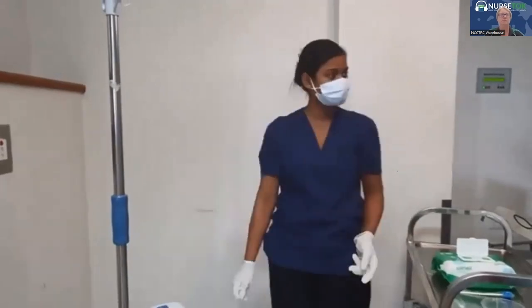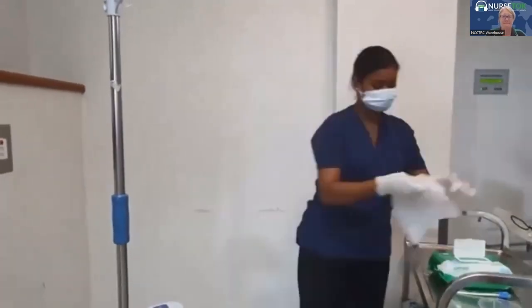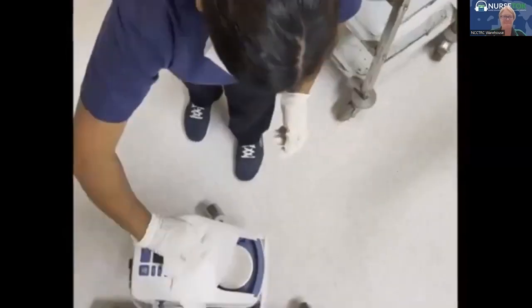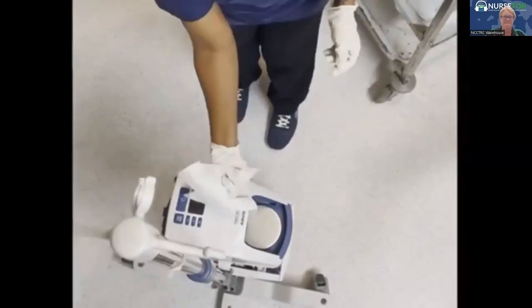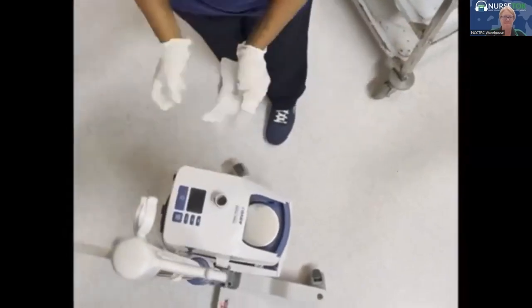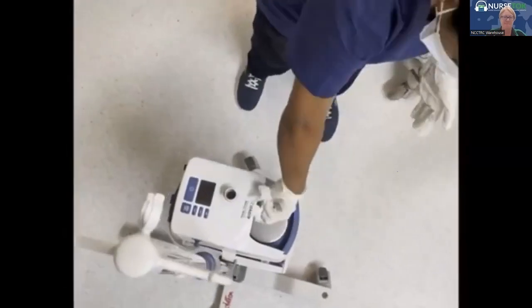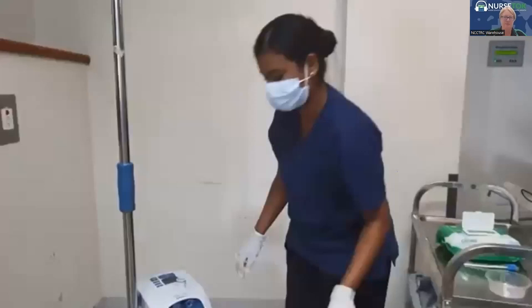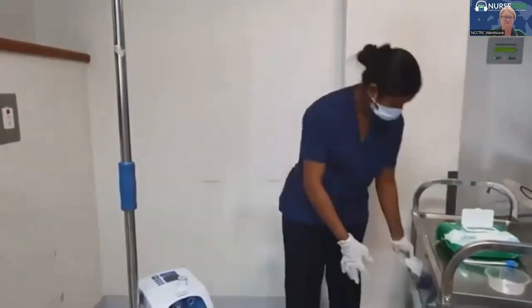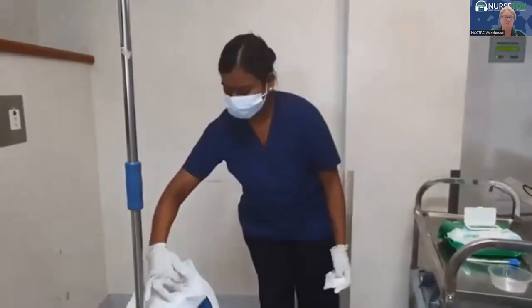Now clean the outlet elbow with a disposable lint-free cleaning cloth. Clean both ends. Continually rotate your finger while cleaning and go as far inside as possible. You can always wipe the outside of the EVO 2 using a disposable alcohol wipe, which you can later discard.